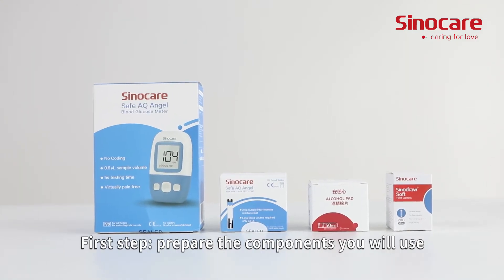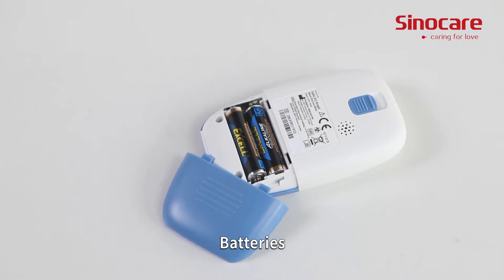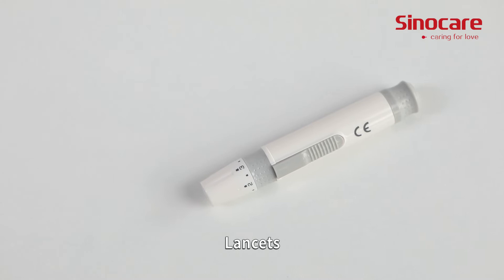First step: prepare the components you will use. You will need batteries, a glucometer, a strip vial, a lancing device, and lancets.